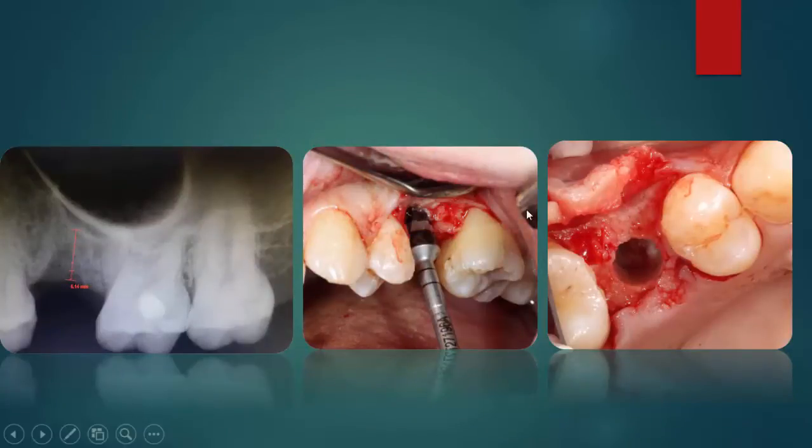وهي حالة تانية كمان عندي ال average bone height حوالي 6 ملم. استخدمنا ال Densification in the reverse rotation at high speed. وملاحظ اللي هون بالكلينيكال فوتو ملاحظ ال floor of the sinus، وملاحظ ال whitish appearance of the osteotomy. طبعا هذا ال whitish appearance هو بسبب انه البودرة العظم compacted along the osteotomy، فبتعطينا هالمظهرات. طبعا حيصير عنا blood perfusion like after a minute, so it's not scary to see الوايت color هذا بالاوستيوتومي. حيصير في عنا blood vessels coming after we place the implants.